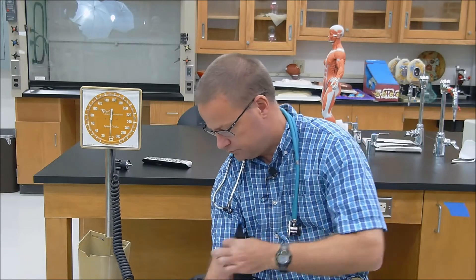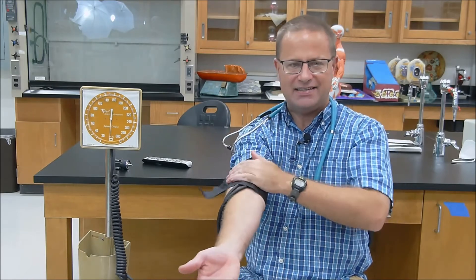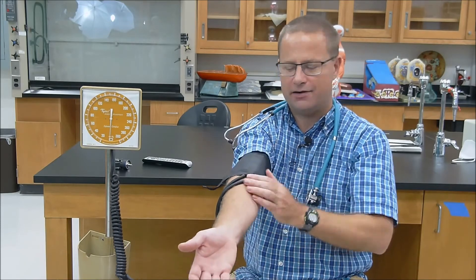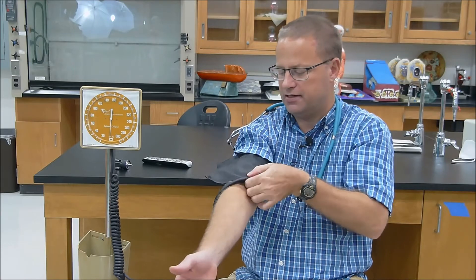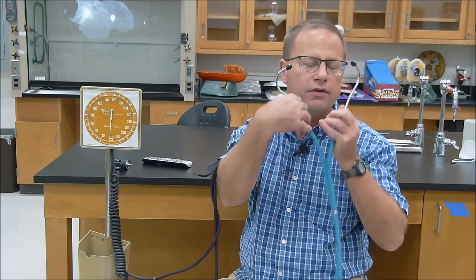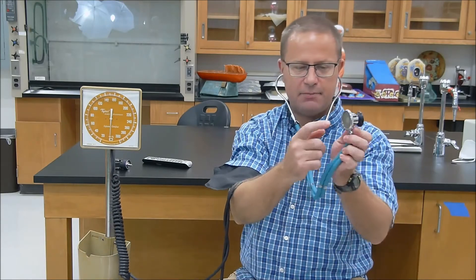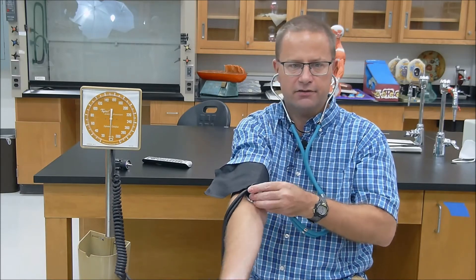So you want to put that cuff on. Again, it's very difficult to put a cuff on yourself, but I'm going to do the best that I can. So I'm going to place my arm in here. This is usually one person doing the measurements, one person having the measurements recorded. I've got it as tight as I can. The air is out, and I want the blood pressure cuff itself up here on the brachium, not down on the anti-brachium. And you want the shirt to be above that, if at all possible. Then you want to put the bell of your stethoscope inside there. I'm going to put my stethoscope on with the earpieces facing backwards. I'm going to tap it, make sure that I can hear out of there. You want the tubes coming out on the antecubital space right here, on the inside of the elbow.